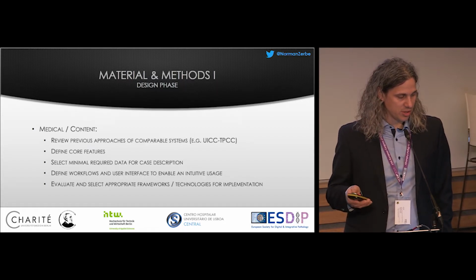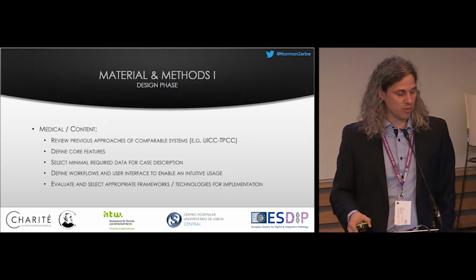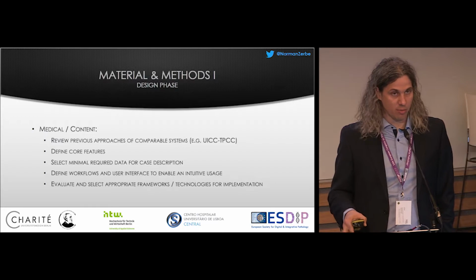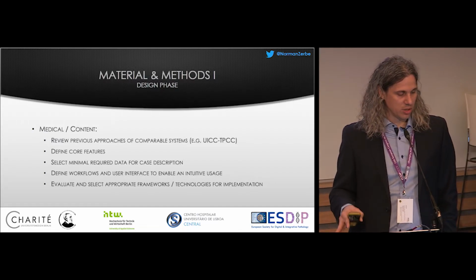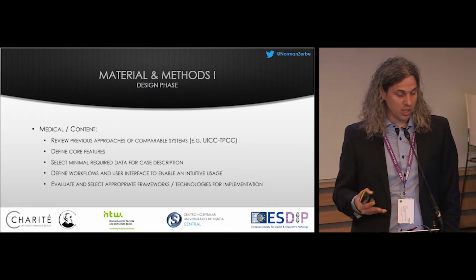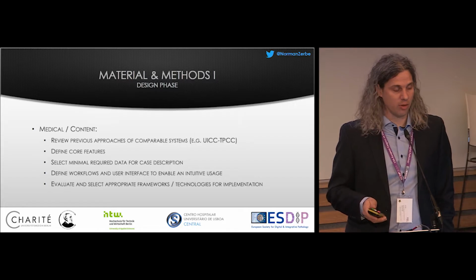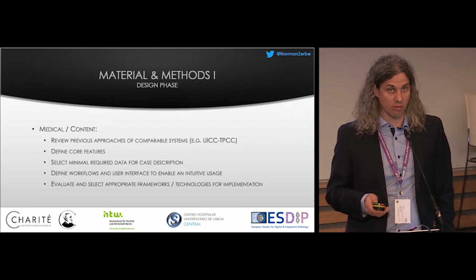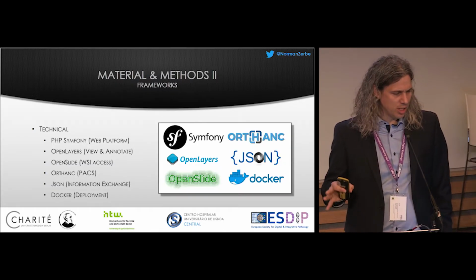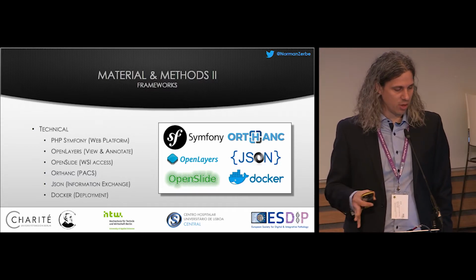We defined the core features and selected the minimum required data for a case description, with interviews of different pathologists from our institute, but also from overseas. We defined workflows and user interfaces to make sure that it's really intuitive to work with. And we evaluated different frameworks and technologies for the implementation, because of course we didn't want to start over from scratch. On a technical basis, we used different frameworks that are available.